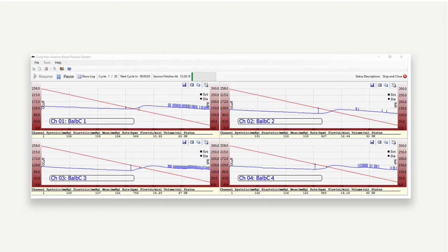The first measurements are your acclimation cycles. If you need to make any adjustments, it is best to do so within this acclimation period.